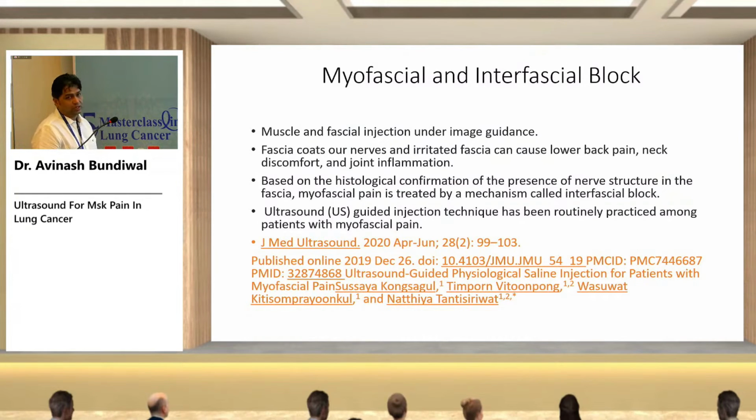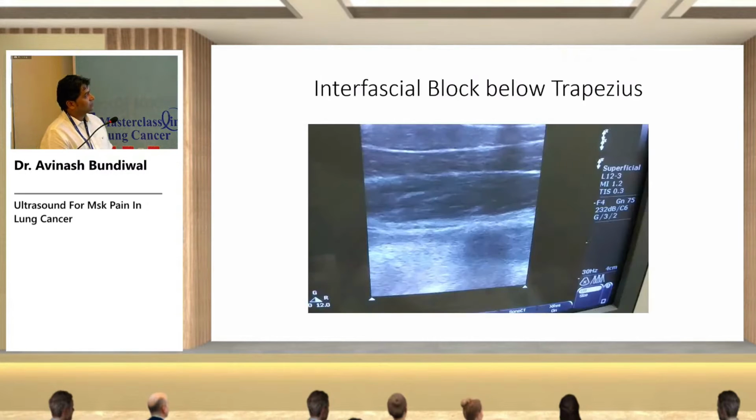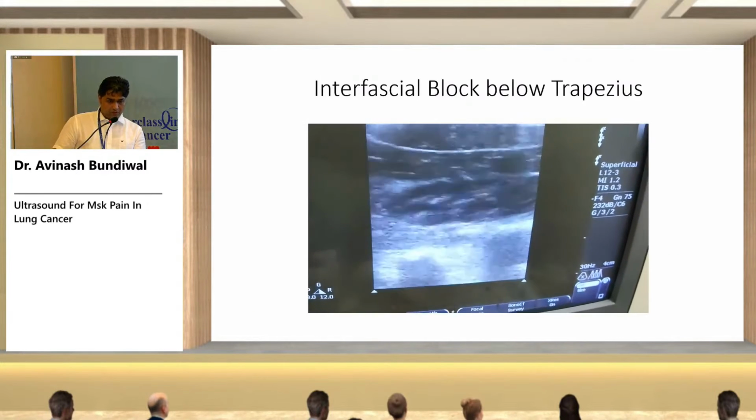Fascia coats nerves as well as vessels, and irritated fascia causes a lot of pain: back pain, neck pain, joint inflammation. So ultrasound guided injection has been routinely practiced among patients with myofascial pain. This is an interfascial block.